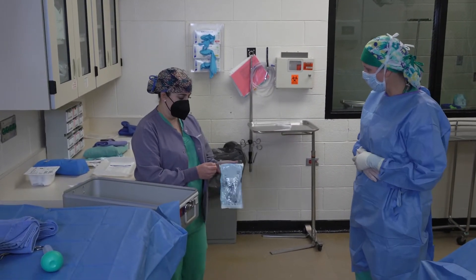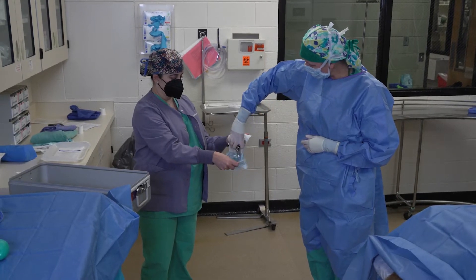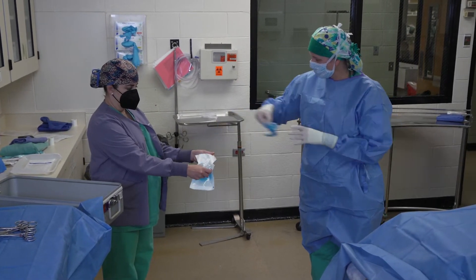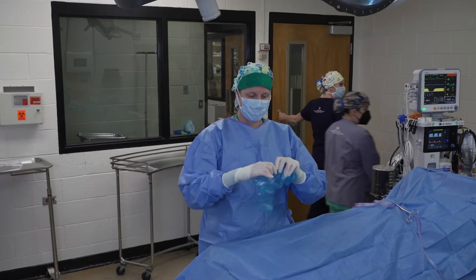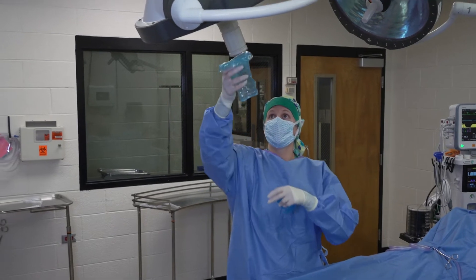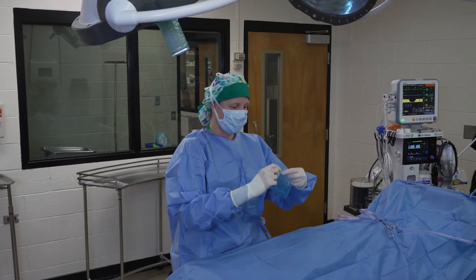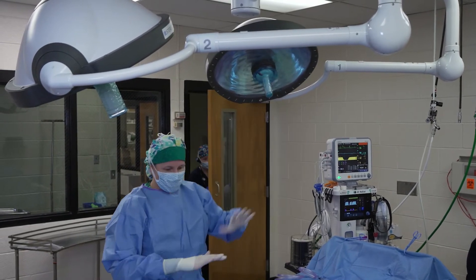We're going to open up some additional clamps. These are non-penetrating towel clamps that we can use on the outside of the drape. I'm also going to use the light handle covers. Before I put these on — because it can be a little tricky — I'm just going to fold over the outer edge to give my hand a little bit of protection. Then I'll slide that over my light handle, being careful only to handle the lower portion so I don't accidentally contaminate my hand. I'll do the same on the other light handle cover. We're doing this at the end when everything is already draped so we don't contaminate.